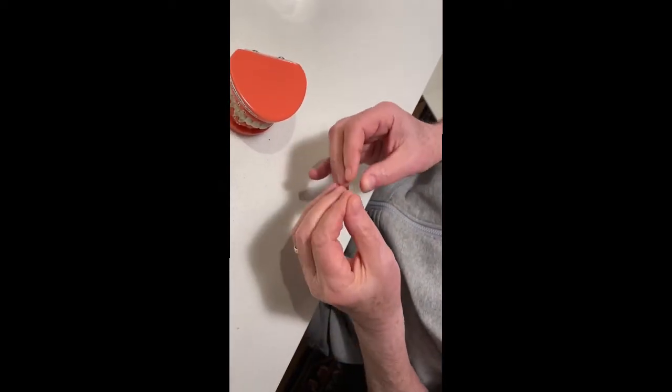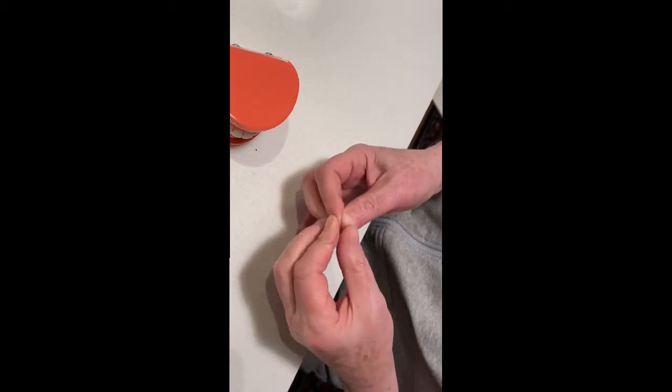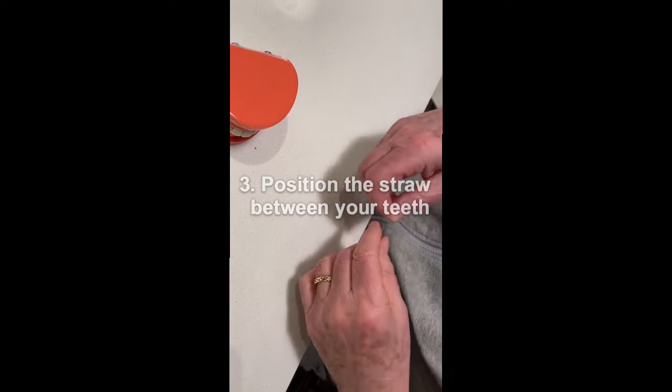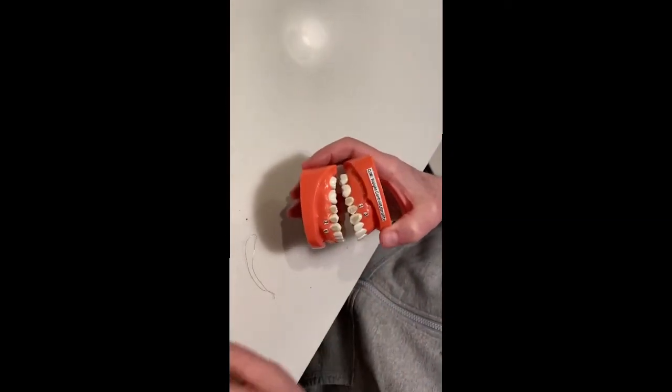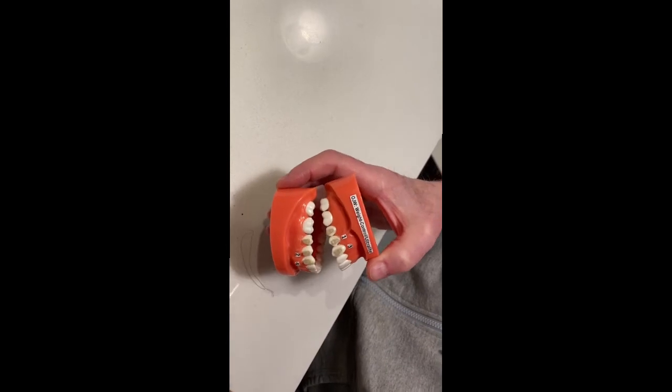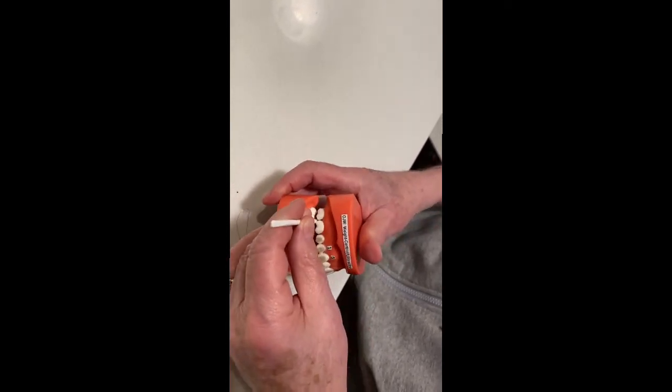Spread it apart, and in your teeth, you will place the straw at approximately the distance you want your teeth to be wired into. Let's start there. That looks about right.